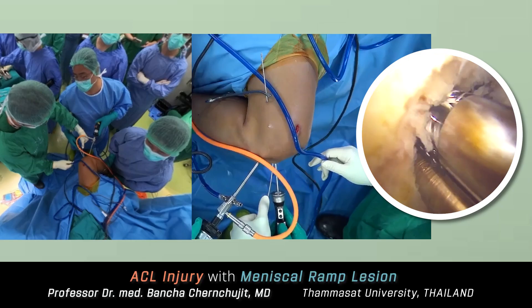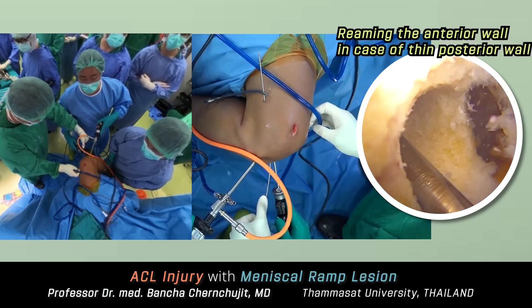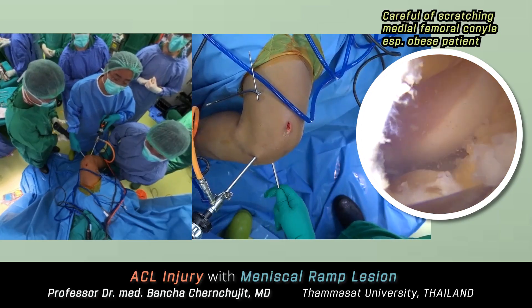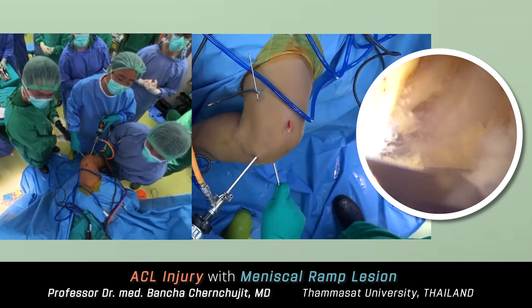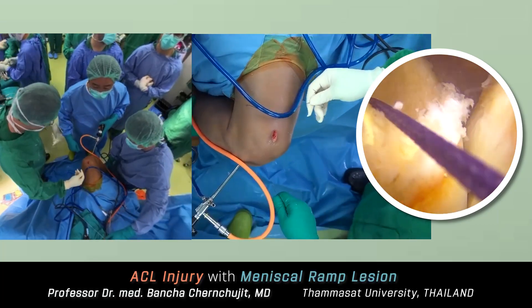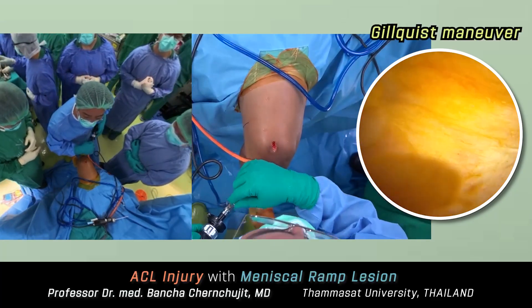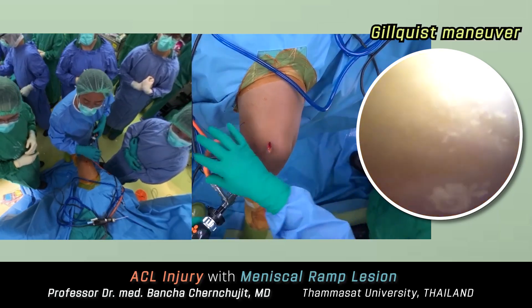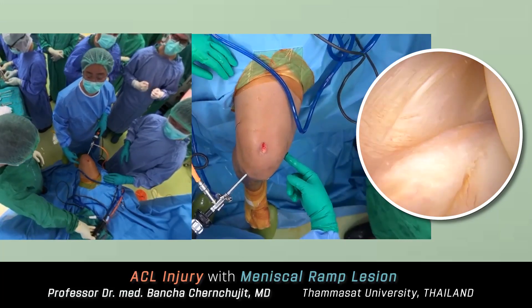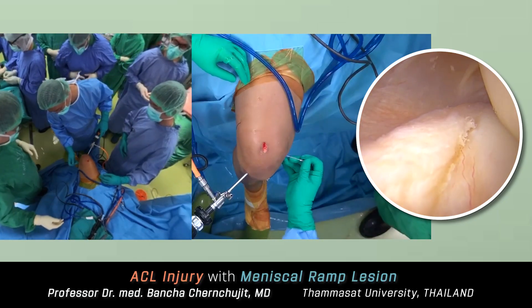Always check the posterior cortex to ensure it's intact. If you find a very thin posterior wall, I recommend reaming a bit at the anterior wall — this causes the reamer to shift forward, allowing you to create a more anterior femoral tunnel. Be careful not to scratch the medial femoral condyle with the reamer, especially in obese patients. I always create the femoral tunnel first before repairing the ramp lesion, because deep knee flexion after ramp repair can damage the repair. For a longer ramp lesion, I would use the intercruciate transeptal approach.